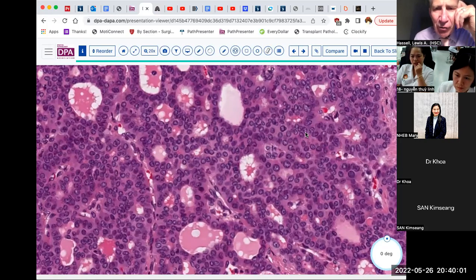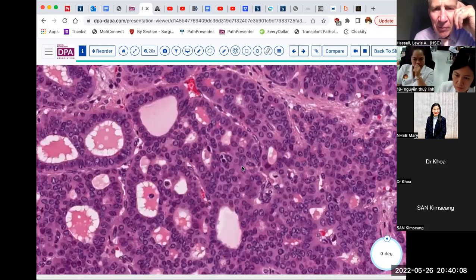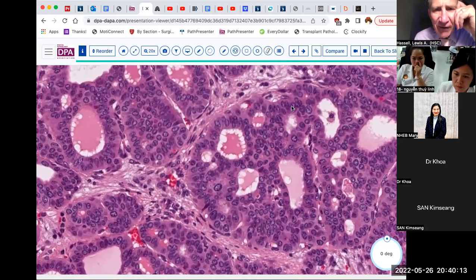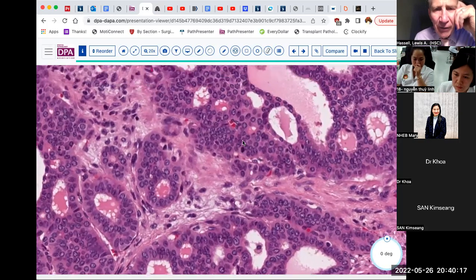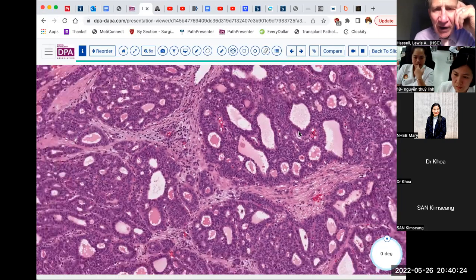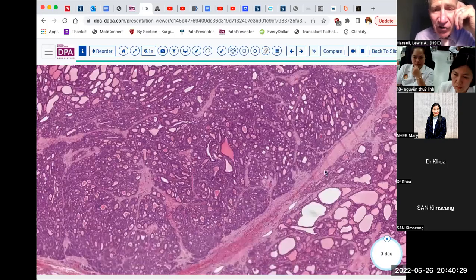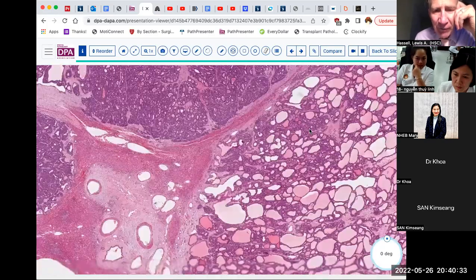Inhibin is usually used in the ovary for sex cord stromal tumors like granulosa cell tumor. It may be positive in the adrenal. And so it's not usually an epithelial type marker that is positive, but it is expressed quite strongly in this particular variant of cholangiocarcinoma. And that is what defines this as the cholangioblastic type of cholangiocarcinoma.